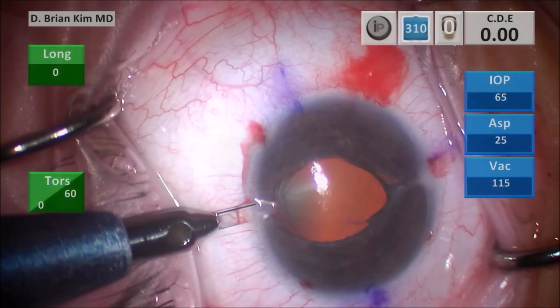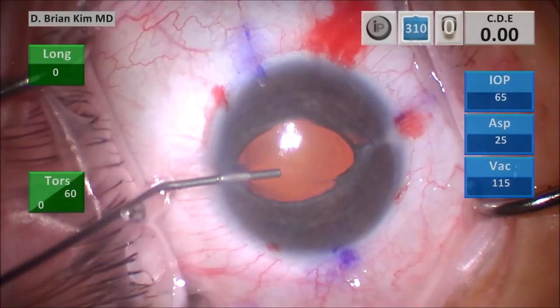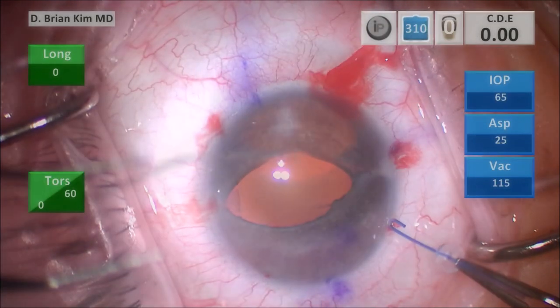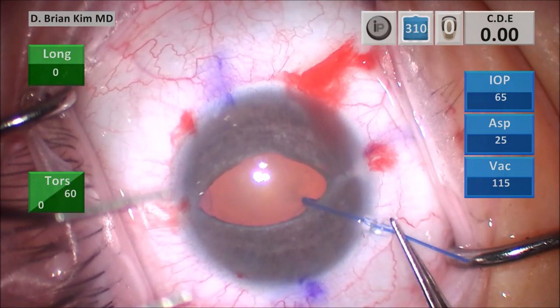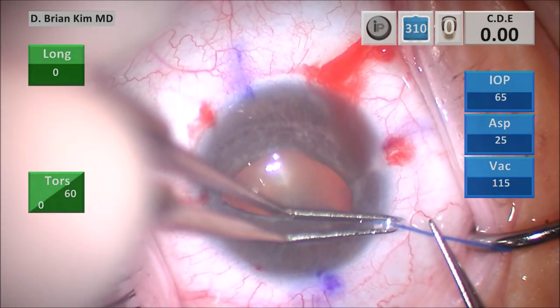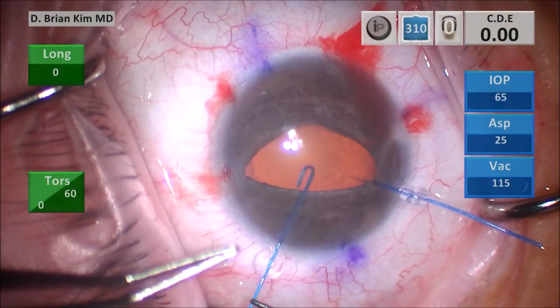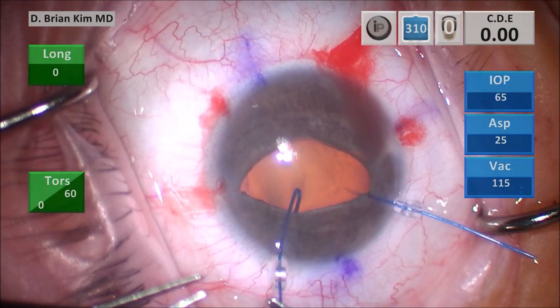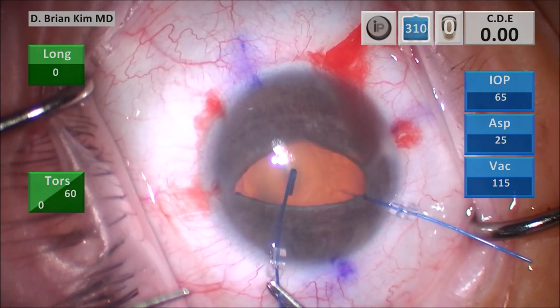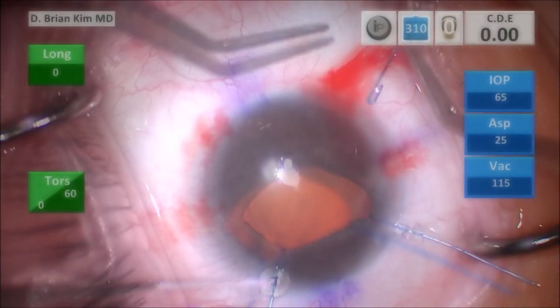I make six total incisions, four of which are going to be used for the hooks. These are the blue hooks — I believe these are from Katena. I have no financial interest in these hooks, but I do like them because they're easy to put in and they have that round stopper which is easy to spin and rotate the tip downward. I prefer to use a two-handed technique: sliding it in with one hand, dialing the stopper, and then pulling and cinching down the hook.